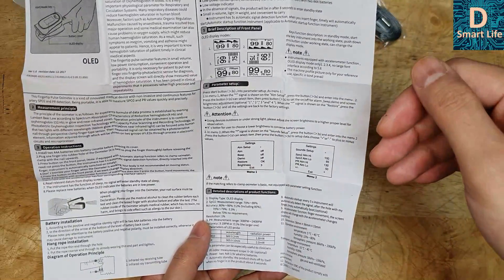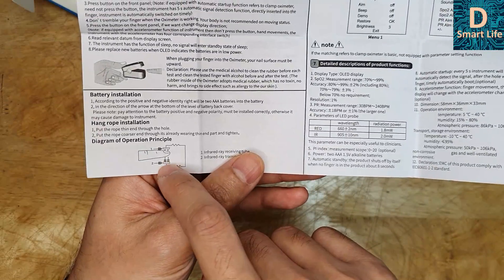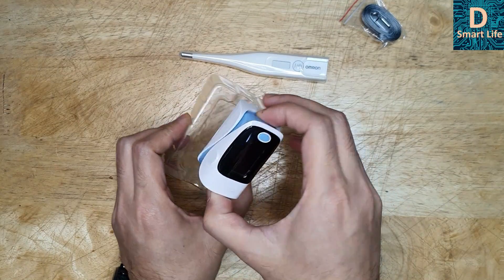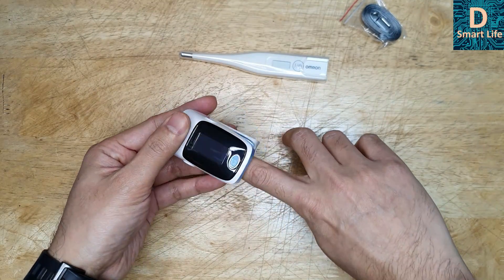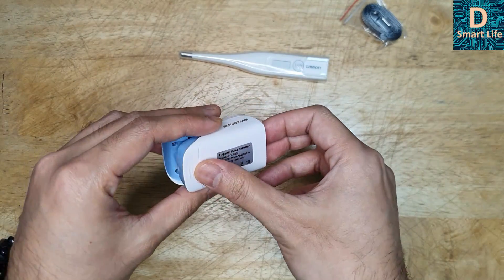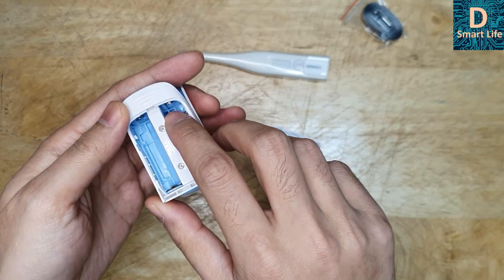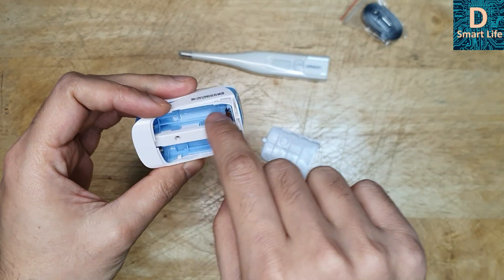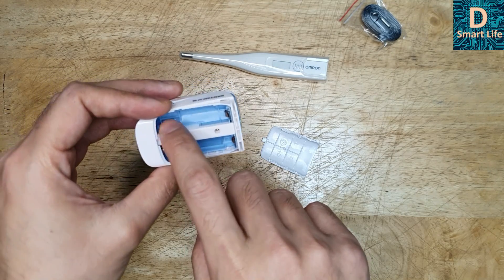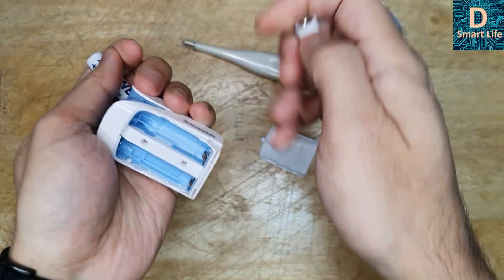You can set it to sound an alarm if the parameters go too low or too high. It's a very simple device. You just put it on your finger like this. Let's put the batteries in first — it takes two AAA cells. You should be careful about the polarity, as it may damage the device if you put the batteries in the wrong way. Check the plus and minus markings carefully before inserting.